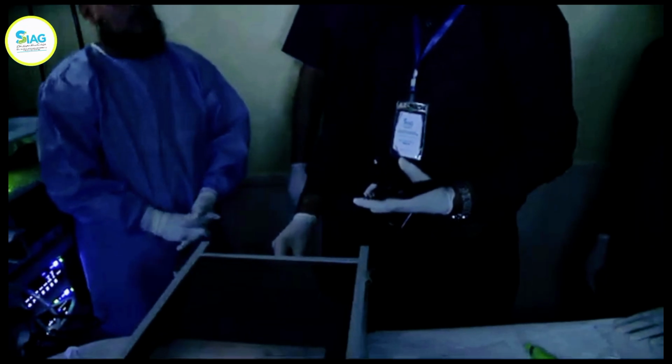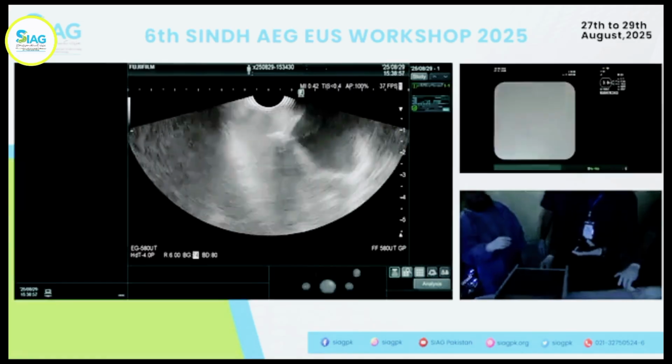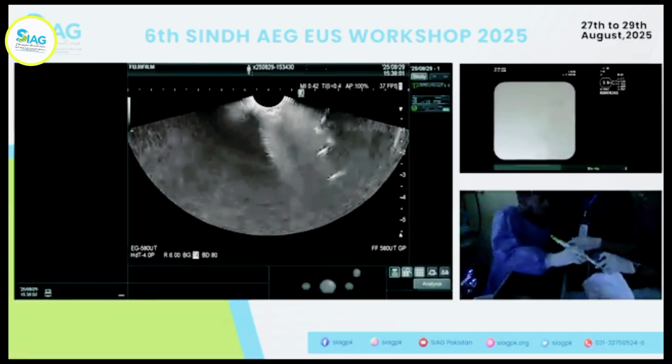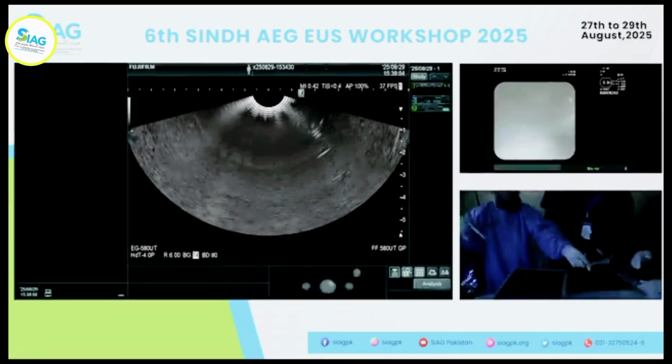Yes, we do. Okay. So I want you to advance the scope and I'll show you something very interesting. This is going to be a real test. Khalid? Ji. This is going to be a real test. Okay.